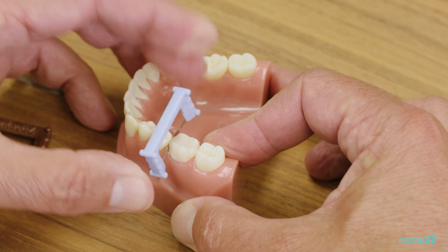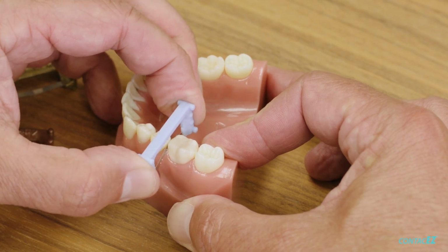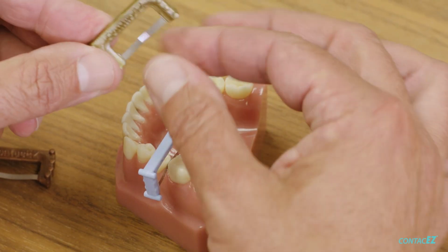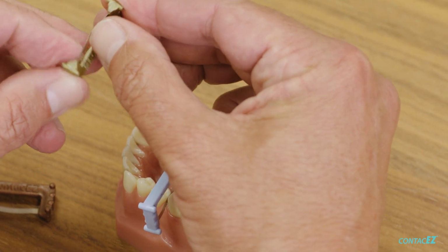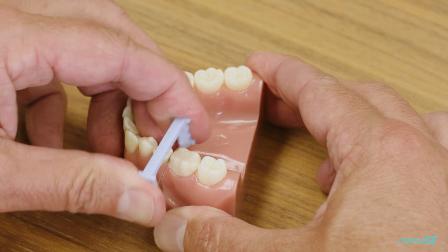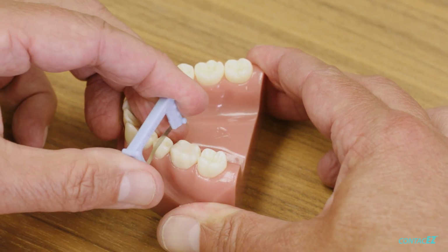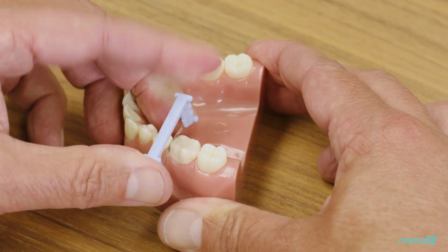But as I'm cutting here, I begin to cut my way through, and then I'm putting some distal pressure on this tube because, again, because of the flexibility of the metal portion of the strip, I want to adapt it around that mesial surface. And then the handle can even be rotated buccolingually as well as we work through and cut through that composite.